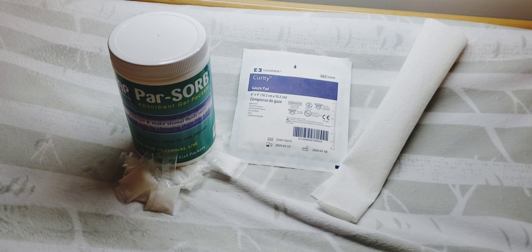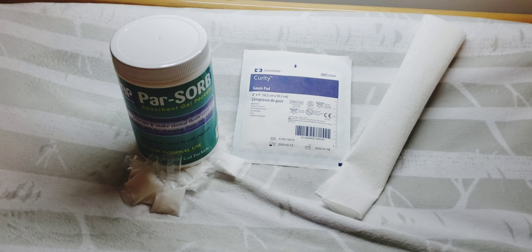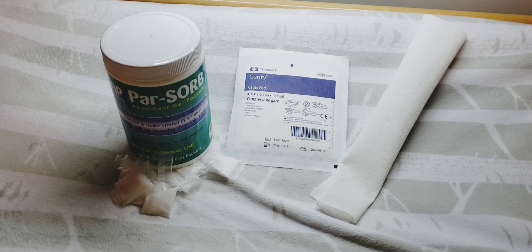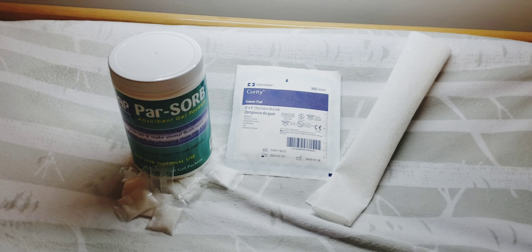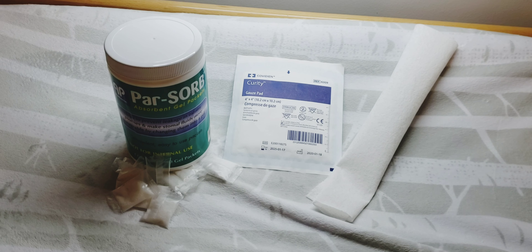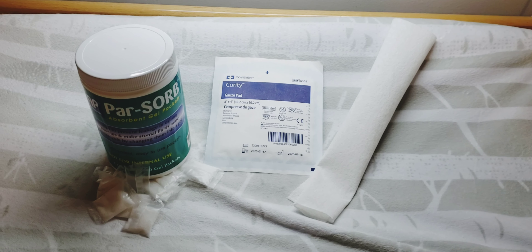They all just absorb it and then you empty like normal and squeeze out whichever one you chose. You can throw several of these in. I found that my hospital doesn't provide the Parsorb, so you may want to bring that with you when you do your clean outs. All right, hope this helps!